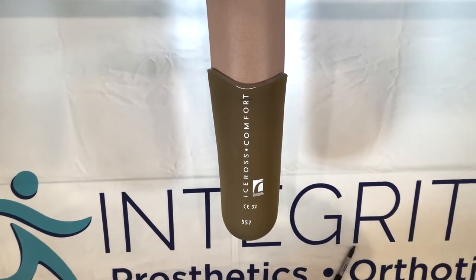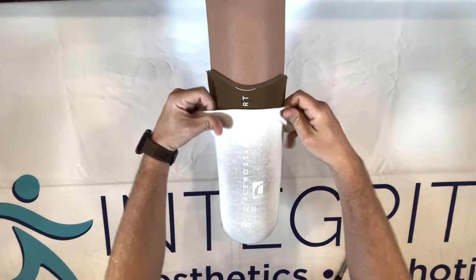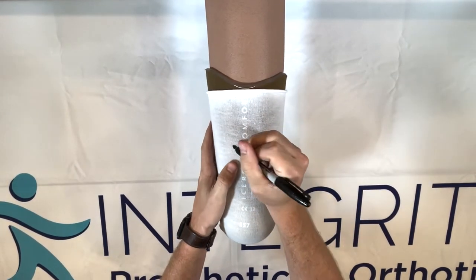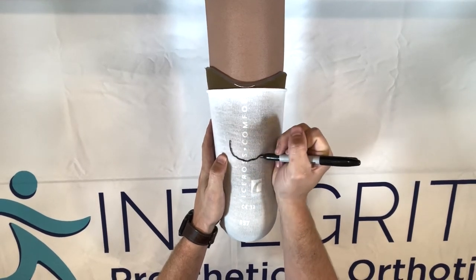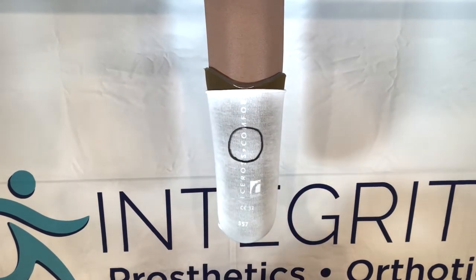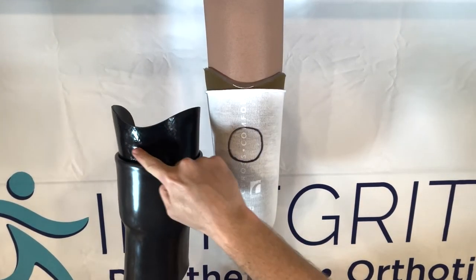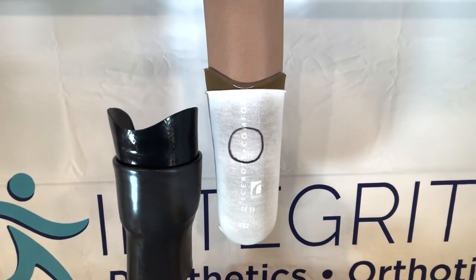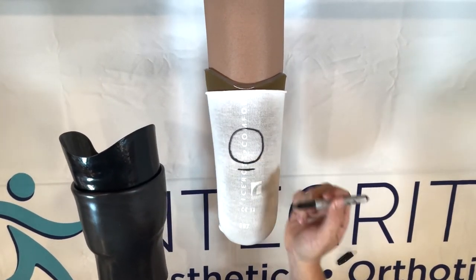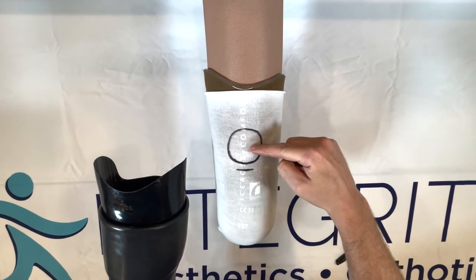I'm going to demonstrate by throwing this sock over so I can draw on it. We're going to pretend this is the kneecap here. The kneecap is a good depth gauge. On all of our sockets you'll notice there's a little indention — we want that indention to be right under the kneecap. We want this socket trim line to finish right about here.